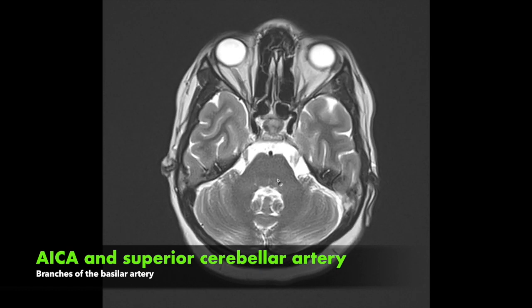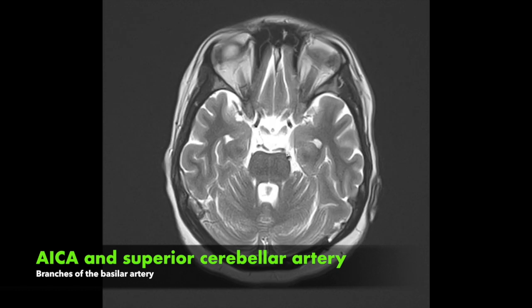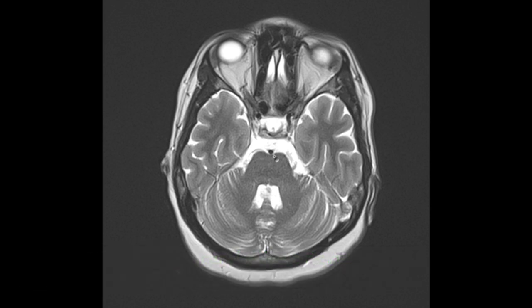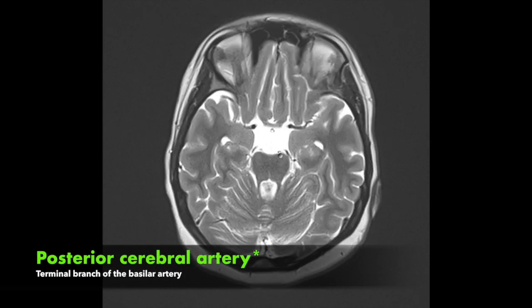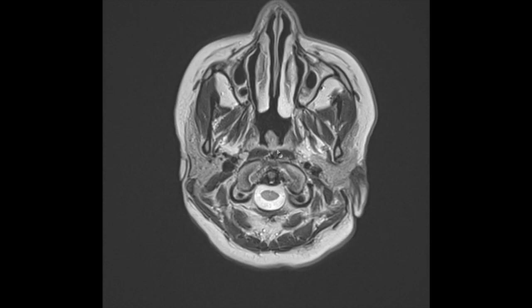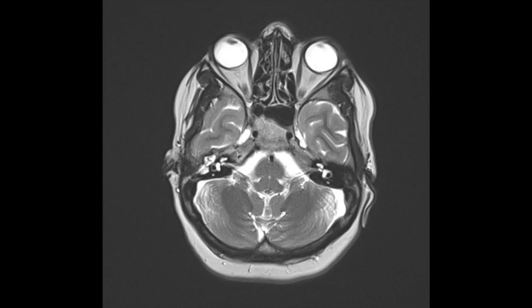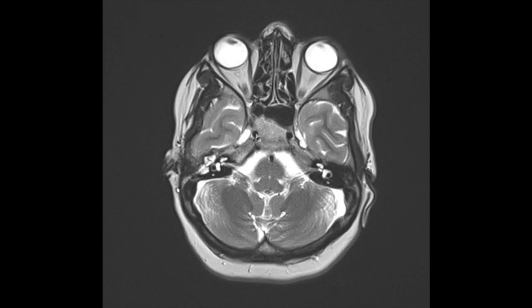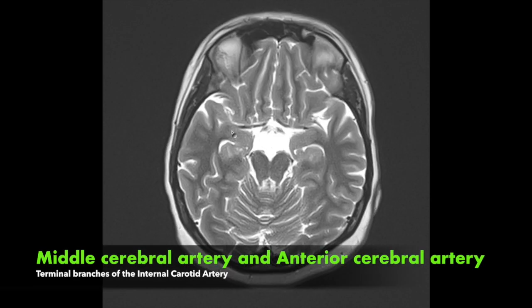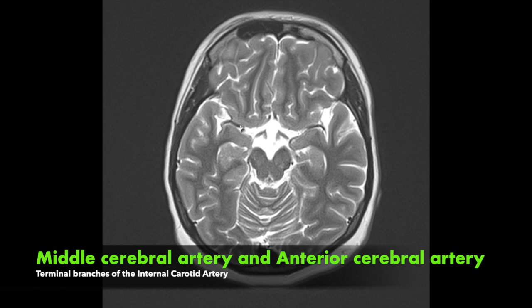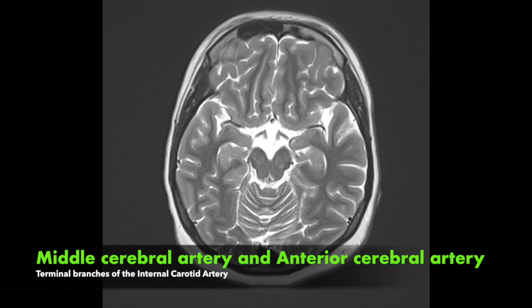Coming further up, you can just about appreciate the superior cerebellar artery coming off the basilar, especially on the right side, before it gives off the posterior cerebral artery bilaterally. At the skull base you can see the internal carotid bilaterally with the internal jugular vein behind it — the internal carotid comes up through the carotid canal and gives off the middle cerebral artery and the anterior cerebral artery.